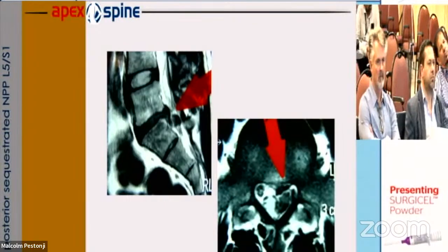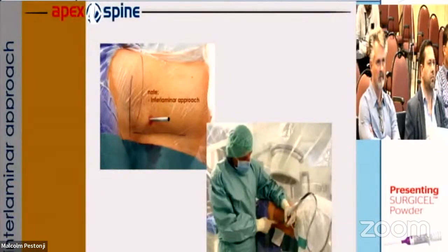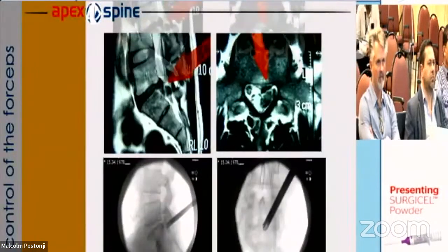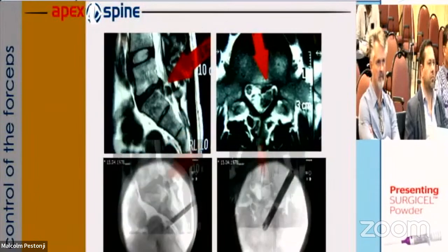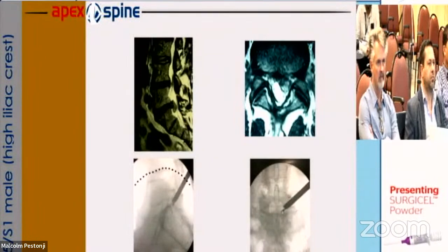Here you see a very seldom posterior sequestrated disc herniation. For that, like I explained in the beginning, you can't do a transforaminal approach, you need an interlaminar approach. And again, here's the control of my forceps. Perfect. Next picture shows you a high iliac crest.